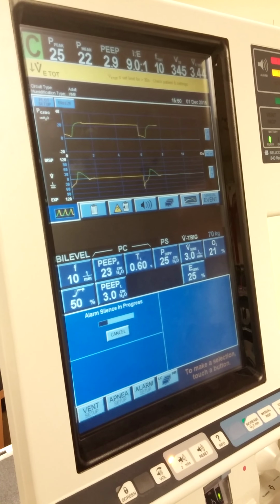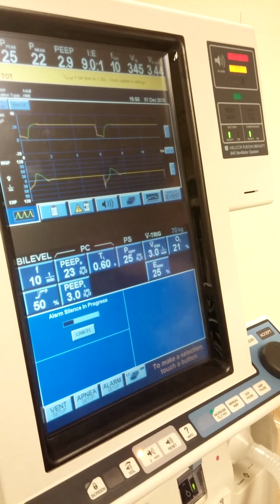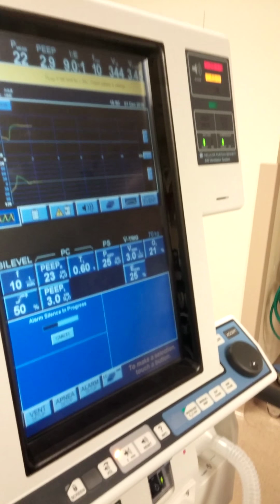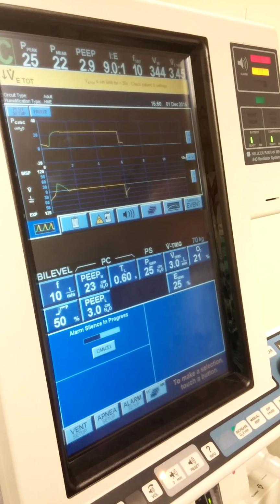Weaning, yeah, the whole drop and stretch thing. My box is this big. That's a mean airway pressure. If I make the box longer but shorter, it's still the same mean airway pressure. And that's how you wean. That's how I wean. They're on a CPAP of, say, 23.